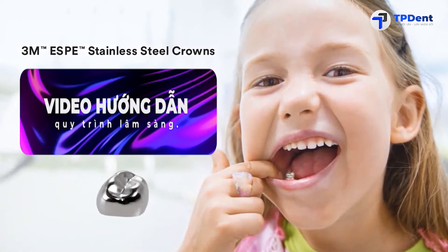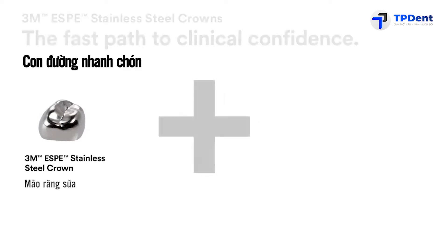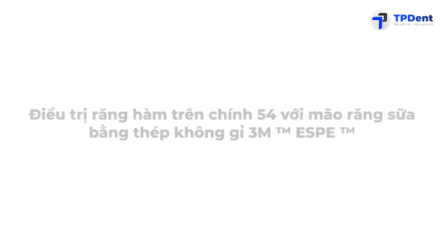With 3M Stainless Steel Crowns, you're on the fast track to clinical. The procedure requires two main products: 3M Stainless Steel Crowns and Relyx Luting Plus Resin Modified Glass Ionomer Cement, or Ketac-M Radiopaque Glass Ionomer Luting Cement.